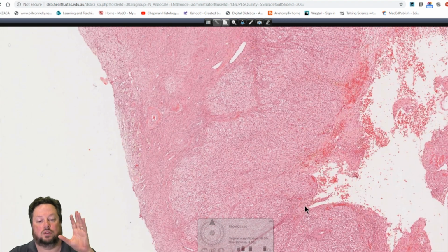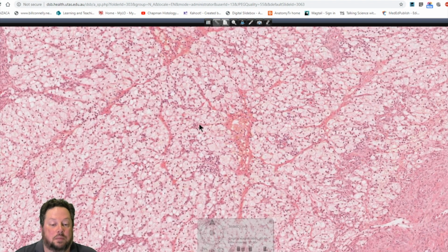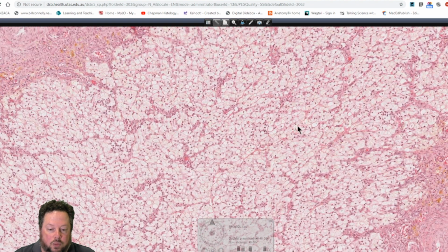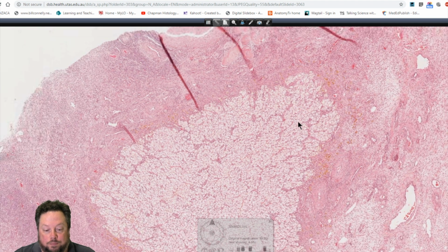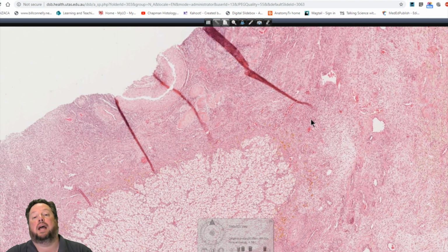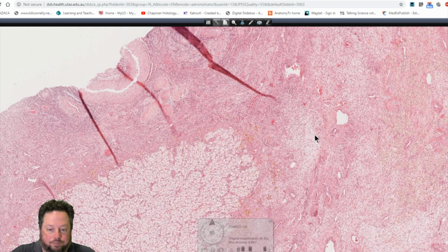Now, if there's no fertilization, there's no HCG secreted, then that corpus luteum degenerates. And it eventually forms this little bit of scar tissue here, which is known as the corpus albicans, which means white body, because eventually these cells break down, they form scar tissue, collagen, and connective tissue fibers, and therefore it appears white in appearance. There's sort of another one here. You can see the very pale regions. So these are the corpus albicans within the ovaries. And so that probably is what happens eventually to the corpus luteum of pregnancy as well, it eventually becomes a corpus albicans.